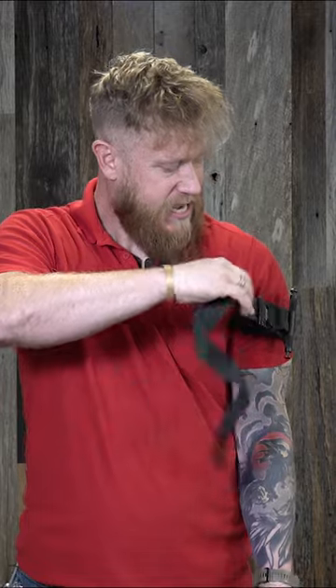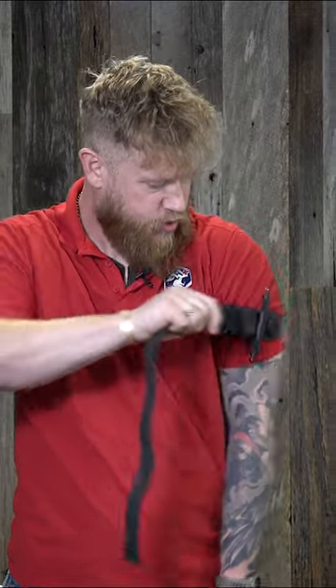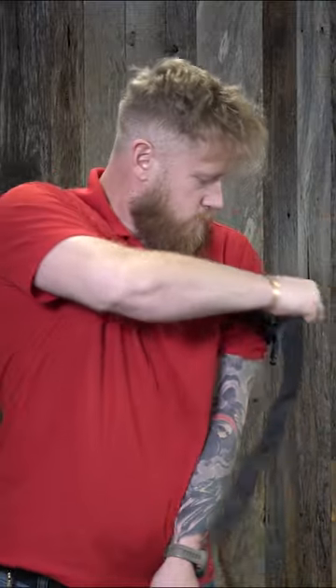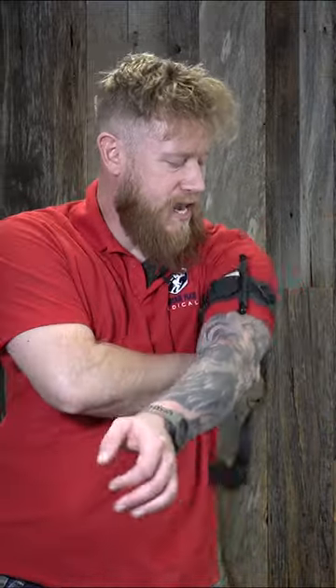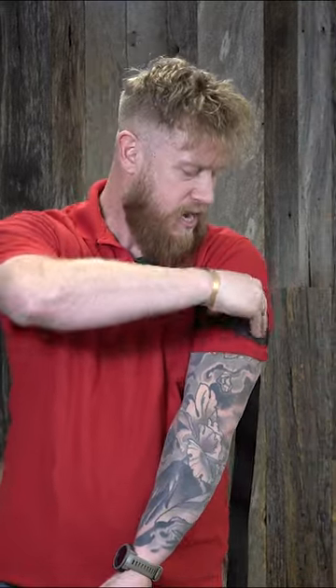I'm going to take the tourniquet, get it up as high and tight as I can, pinch my arm to my side, and then do a ratcheting motion to get this tourniquet as tight as I possibly can first. That is the most important step so that we can crank this tourniquet down nice and tight.